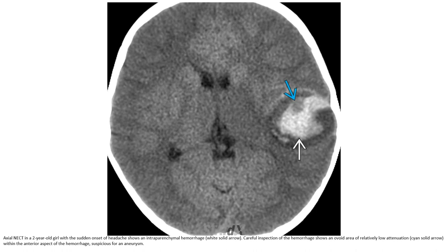Intraparenchymal hemorrhage. Careful inspection of the hemorrhage shows an ovoid area of relative low attenuation within the anterior aspect of the hemorrhage, suspicious for an aneurysm.